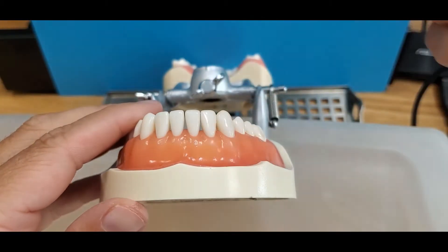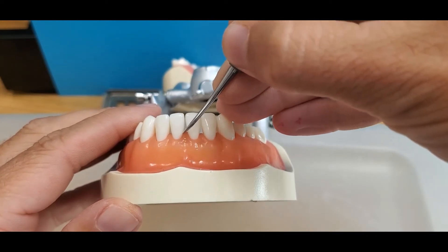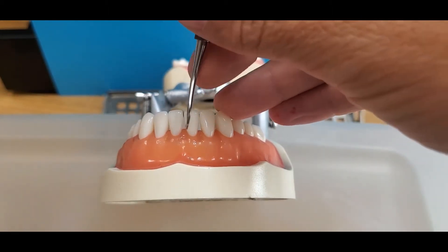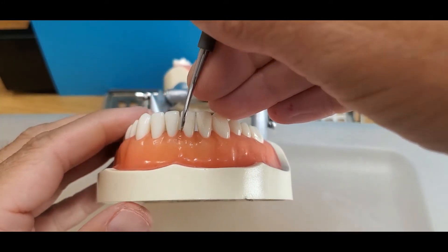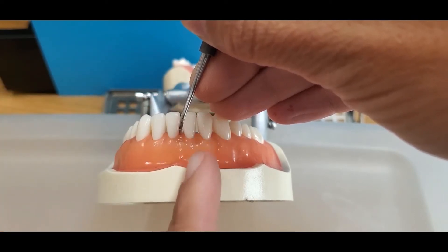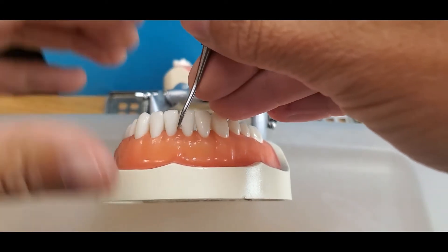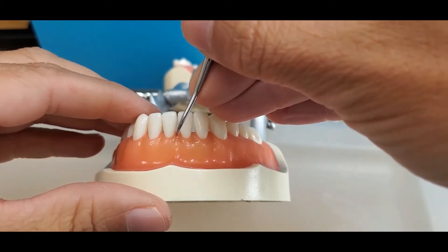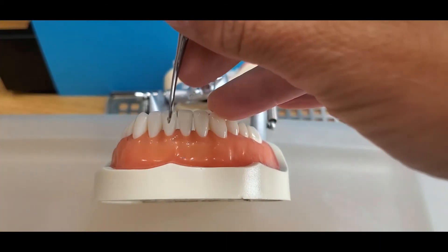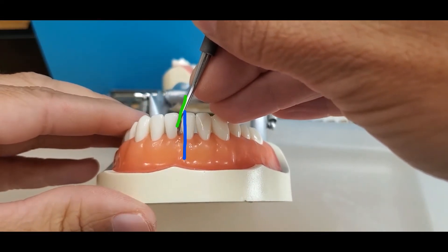It can be tricky if you move your fulcrum position at all. So keep your fulcrum in place, use your opposite end to turn the instrument, and then look at which one has the terminal shank more parallel to the long axis of the tooth. This one you can see crosses the tooth and is incorrect. This is the correct working end for mandibular anterior surfaces towards.